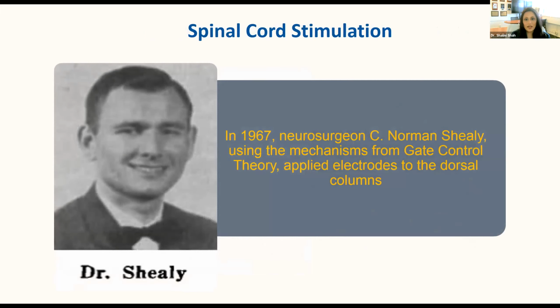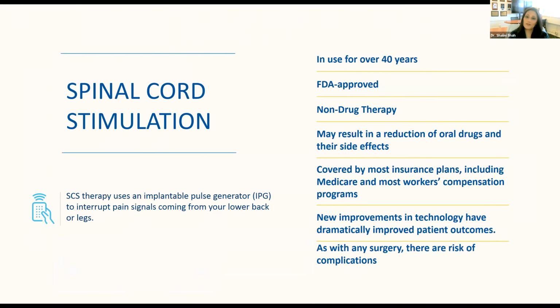Then in 1967, a neurosurgeon named Dr. Norman Shealy, who's still alive today, used the concept described by Drs. Wall and Melzack to create electrodes that he would implant surgically along the spinal cord and hook up to a battery for pain relief. And then we have come to where we are right now, which is the sophisticated mechanisms of spinal cord stimulation. The technology has been developed for over 40 years. This is nothing new. It's not a breakthrough medical device that has just come out. We know how it works. We've tried it for over 40 years, tried and true, and we know the side effects and what to expect from it. It is FDA approved for pain. And the benefit of it, in my personal opinion, is that it's a non-drug therapy.